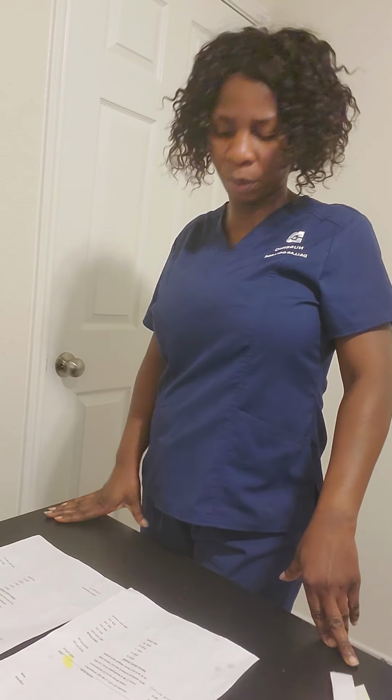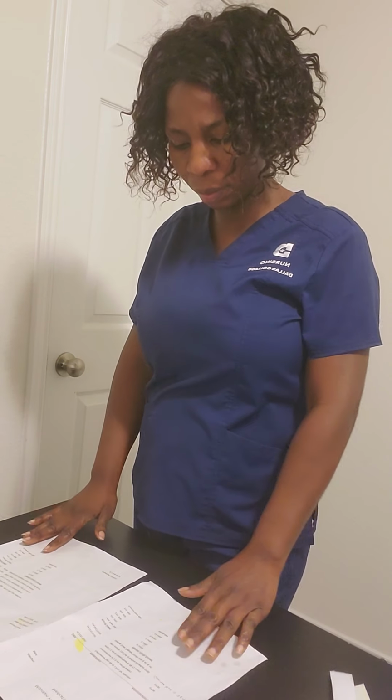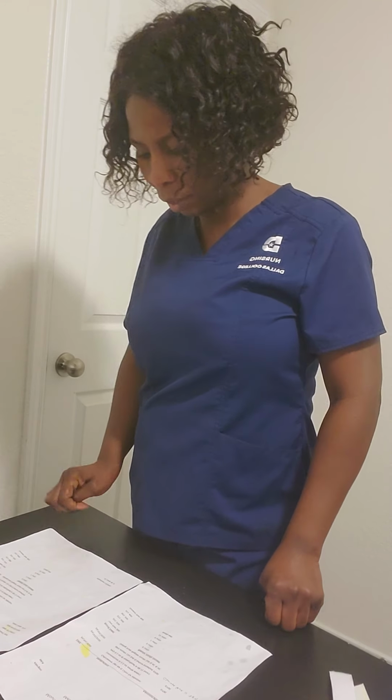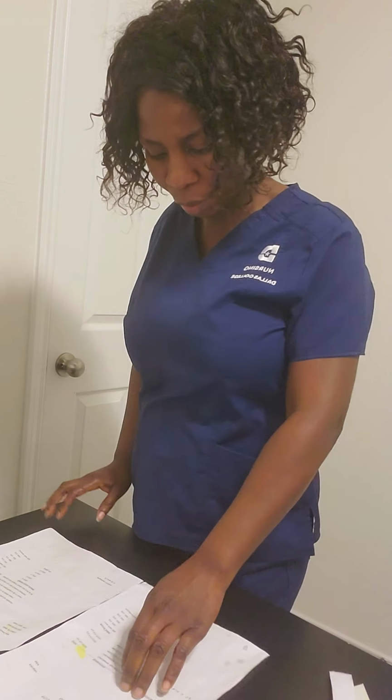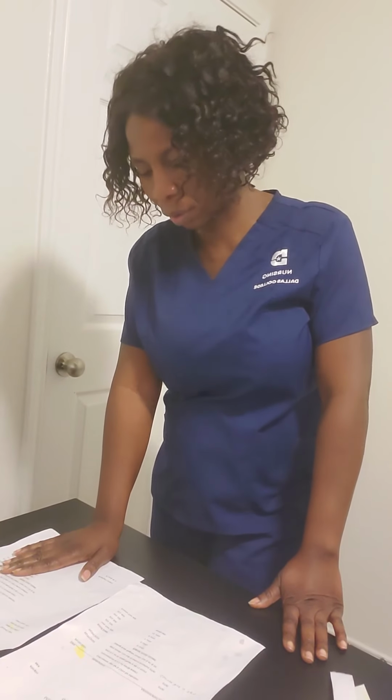In this video, I'm demonstrating medication and injection preparation, and I have the physician order and medication record, which I'm going to be comparing in order to validate the six rights, which are right patient, right medication, right dose, right time, right route, and right documentation. I'll be looking at the physician order and medication record to see if the information in the medication record is right with what we have in the physician order.